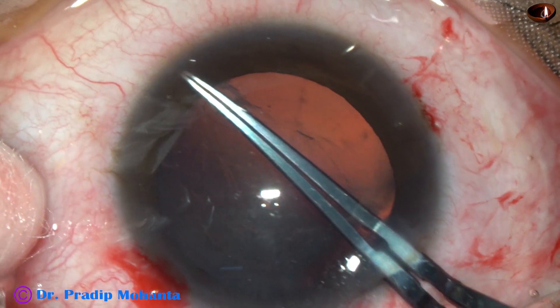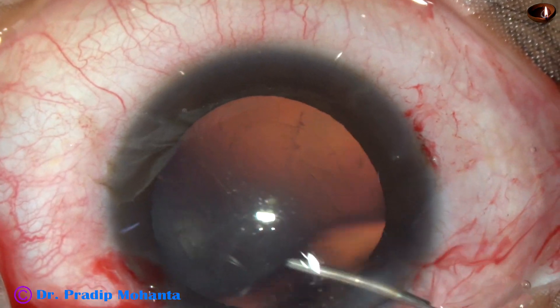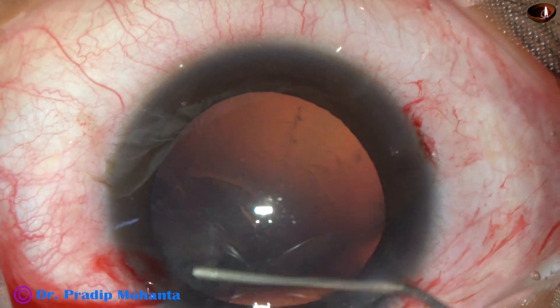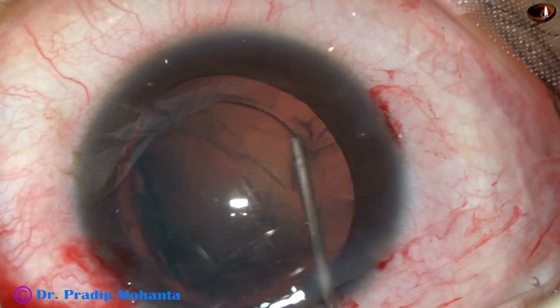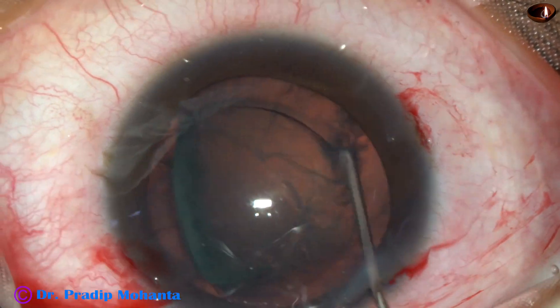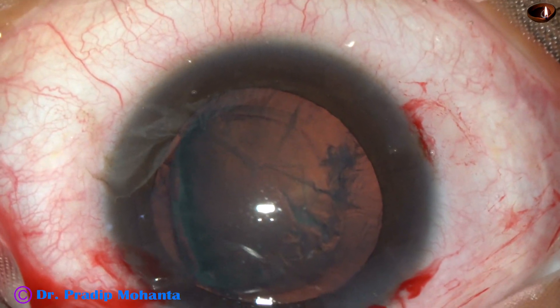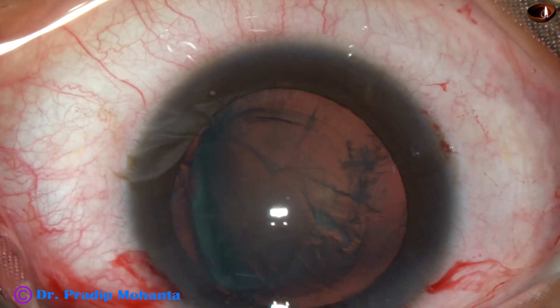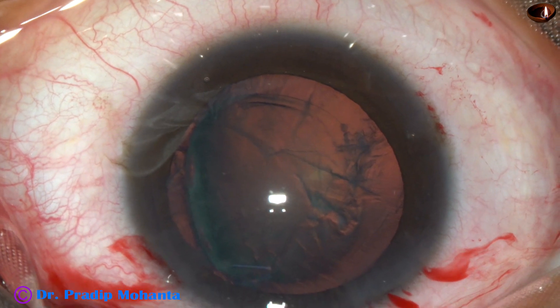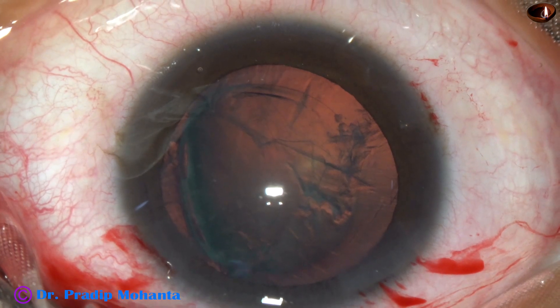In soft cataracts, my aim is to do a rhexis between 5.5 mm and 6 mm. Now, as I do hydrodissection, see the lens mass gets tilted — and this is good. If this happens, don't try to reposition the lens mass into the capsular bag. Just start eating up the lens, the portion which is just above the plane of the anterior capsule — that is the supracapsular portion of the lens mass.